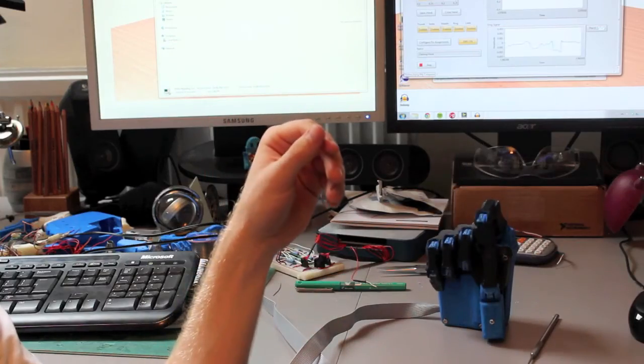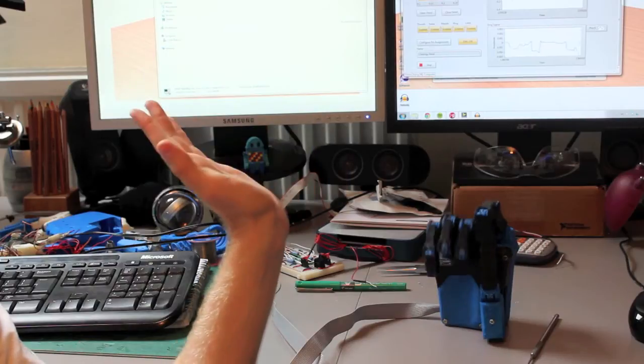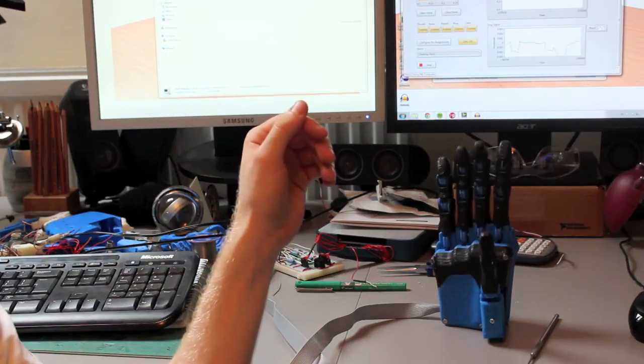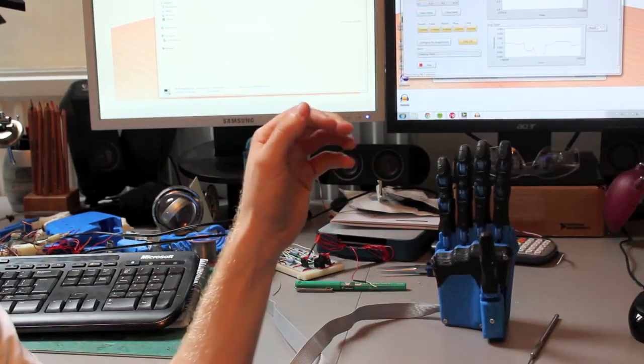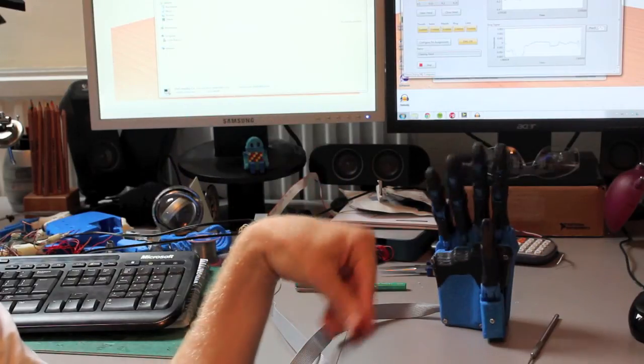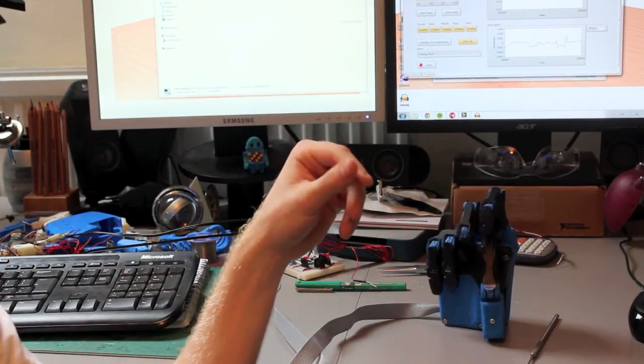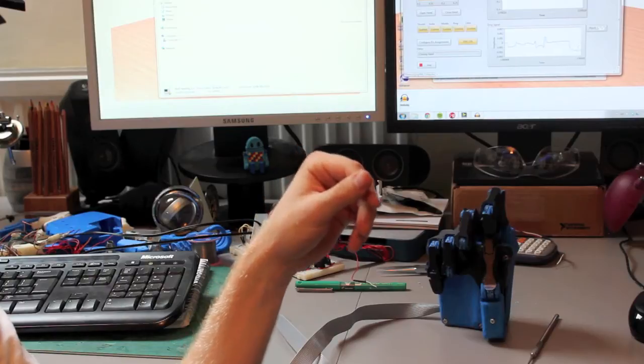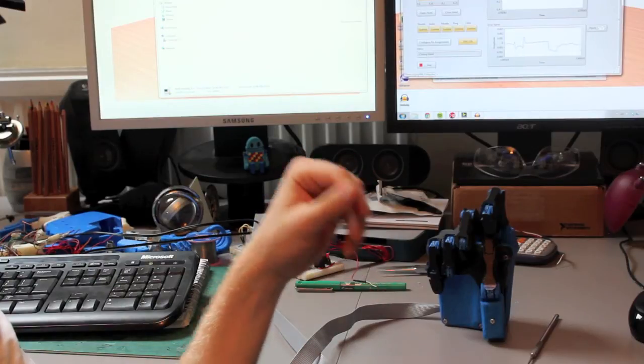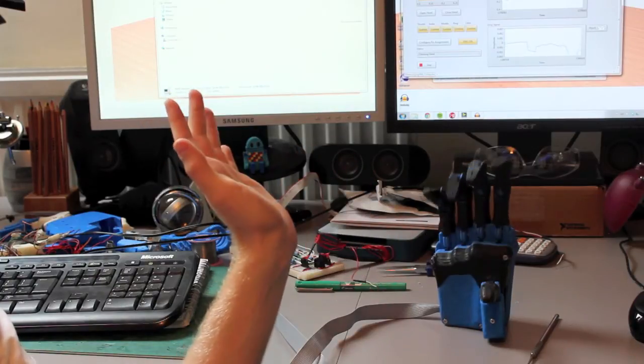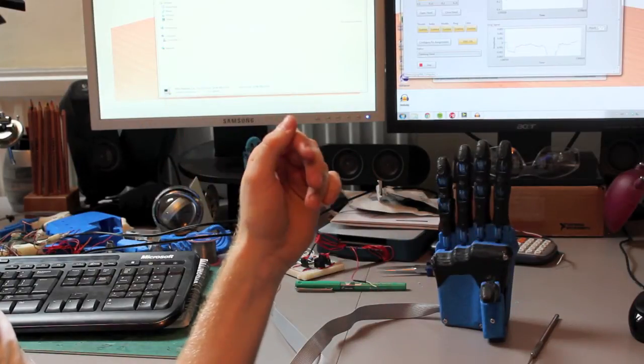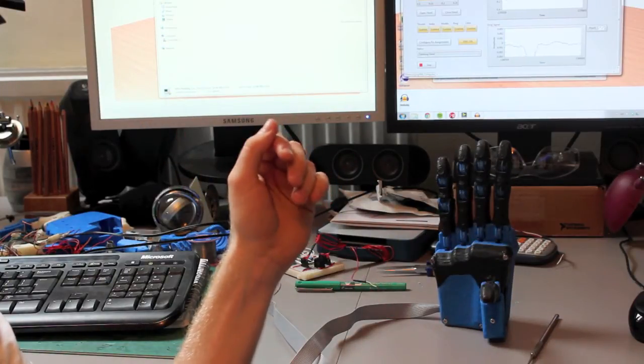Through electrodes that are placed on the front and back of my forearm, I can control the hand. So if I move my wrist downwards, the hand will close, and if I flex my wrist upwards, then the hand will open.